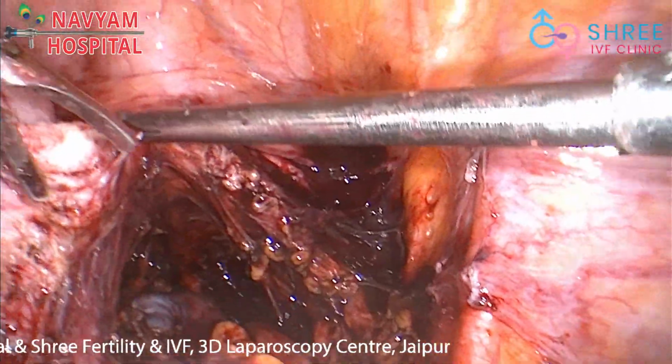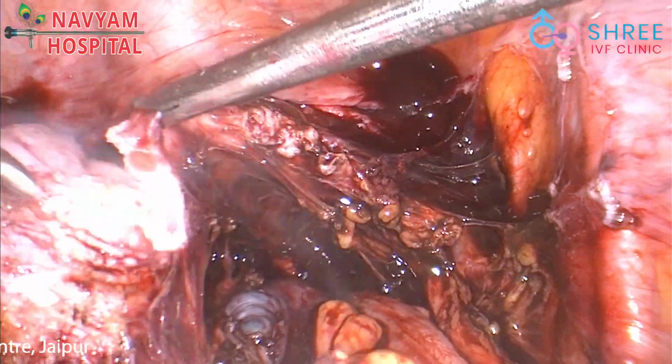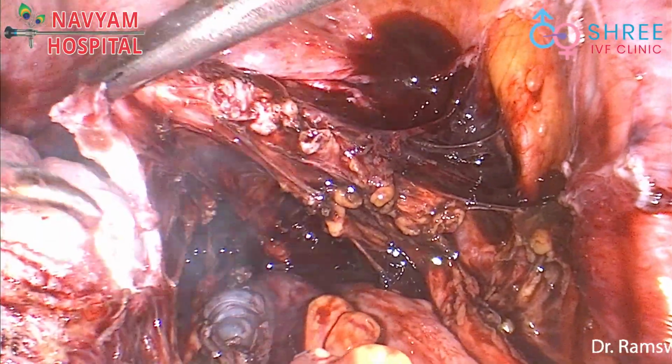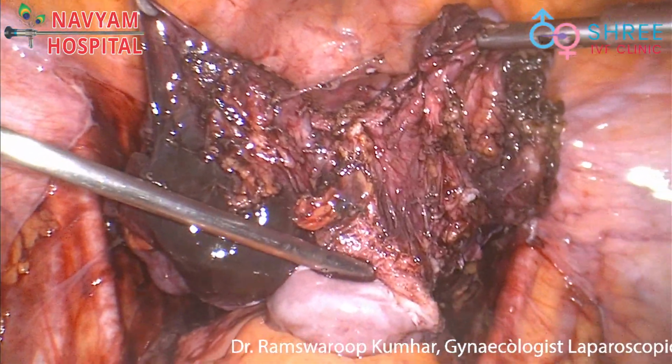This is the final cut of the vault, and the specimen was separated from the vagina. You can see this is the whole specimen, and the specimen was delivered out intact via the vagina.